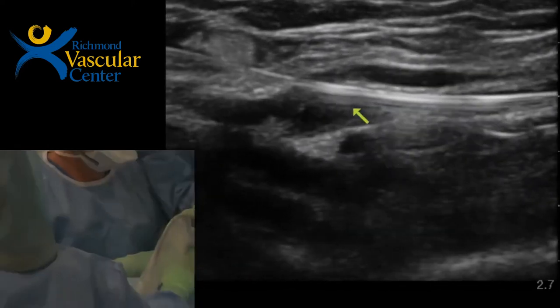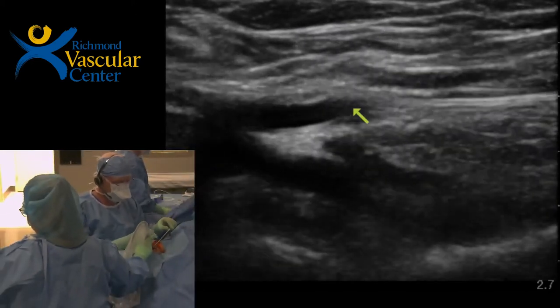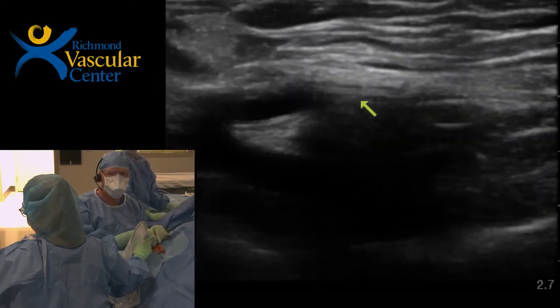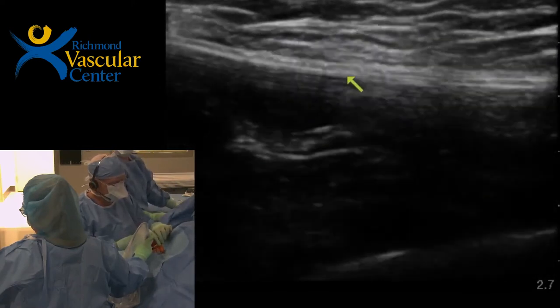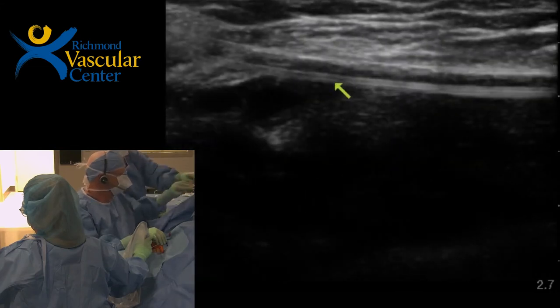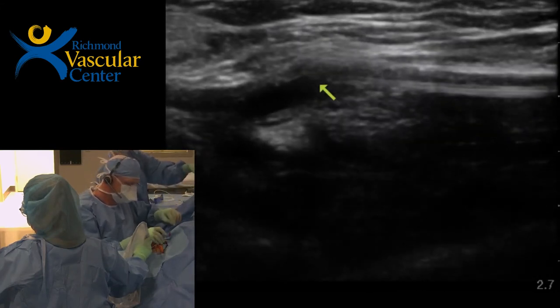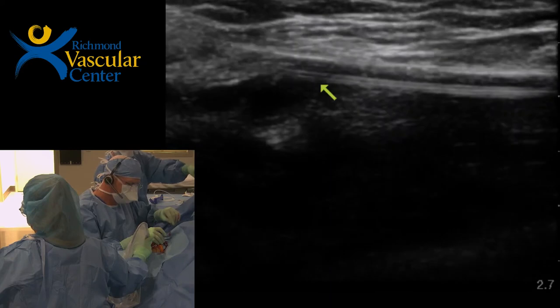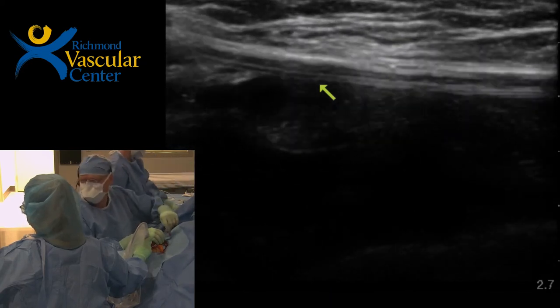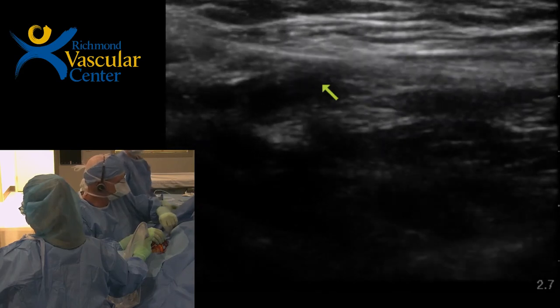I love the way your ultrasound has an arrow that automatically highlights the crossing point into the artery. The automatic, yeah. Well, that's Wendy's doing that as well. Yeah, a little AI here. She tries to show me where to go, really, just in case I forget.